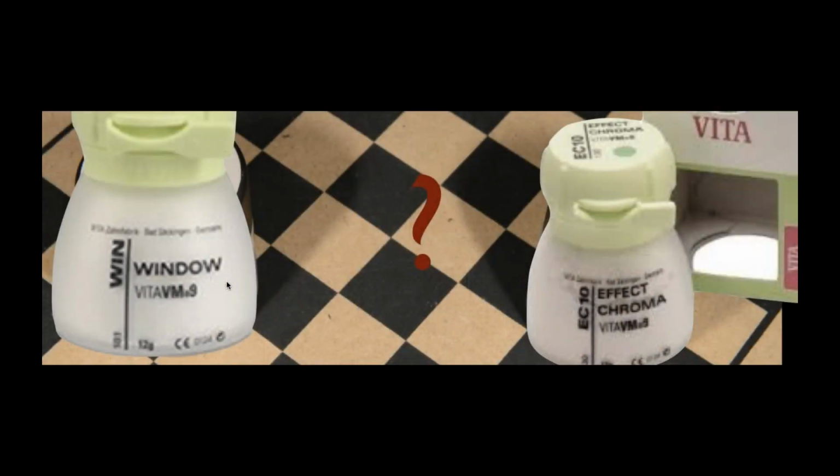I like to simplify it. In the end, 95% of the time, I'm finishing my restoration with some sort of translucency. Internally, I'm looking for some sort of opacity. Now, the challenge is what happens in the middle of those spaces, and that really depends on if I have 1 millimeter or 5 millimeters to deal with. But I do need to have the same parameters. I need something opacified inside and more translucent towards the outside. Standard, it's kind of the way that works for me.